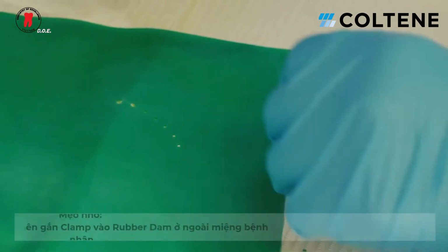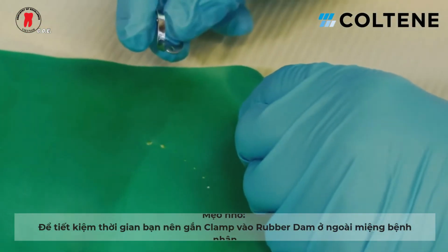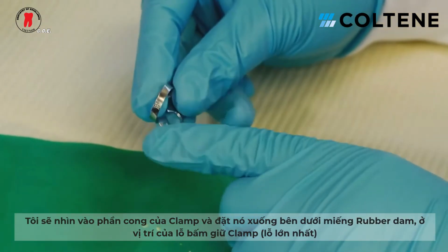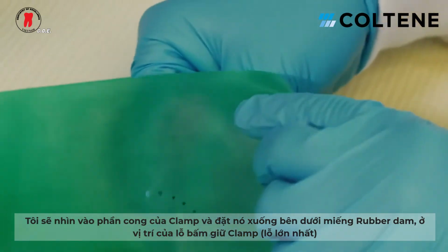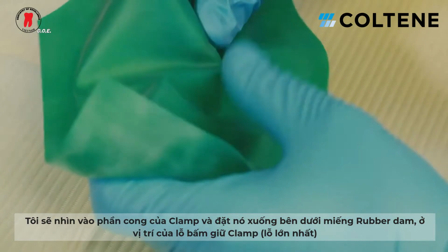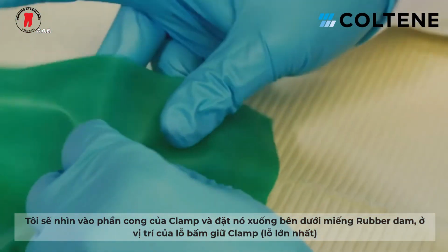A quick tip that I can give you is always attach the clamp to the rubber dam outside the patient's mouth. So what I normally do is I grab the clamp and I'm looking at the bow of the clamp. I put it underneath the rubber dam and I'm going to set it right into that hole that belongs to the retentive clamp, which is the W3 that I'm using right now.